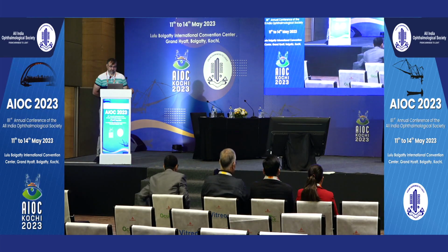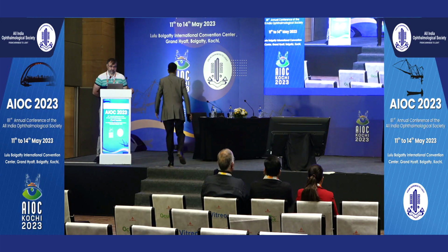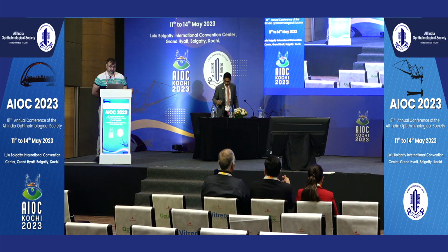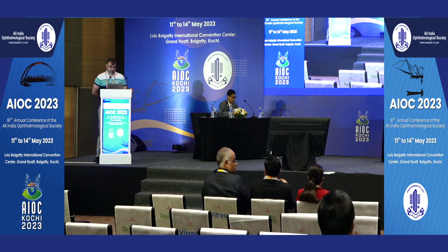I'm Dr. Sangeet Mittal. I'm a VR surgeon practicing in Jalandhar, Punjab. It was a nicely managed case. I think you did your best. A few things that I would have done differently: if the cannula is going inside the suprachoroidal space again and again, I would not have hesitated using a 6 mm cannula in this case. Though the patient was phakic, when you put the 6 mm cannula and you don't manipulate it too much, it won't cause cataract, right? So that was one thing.